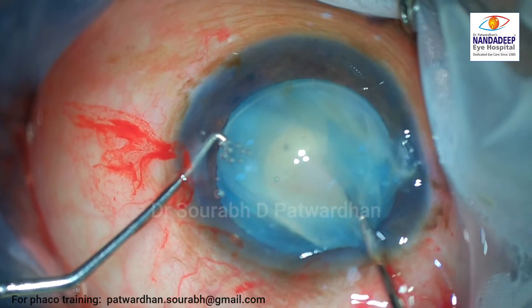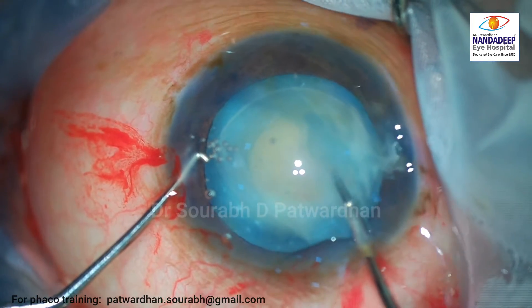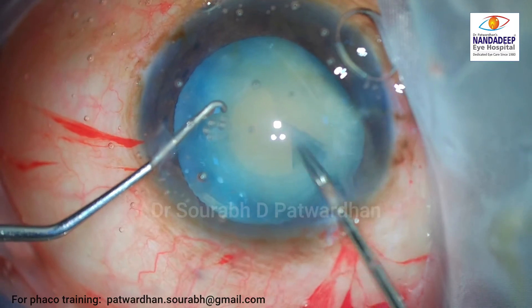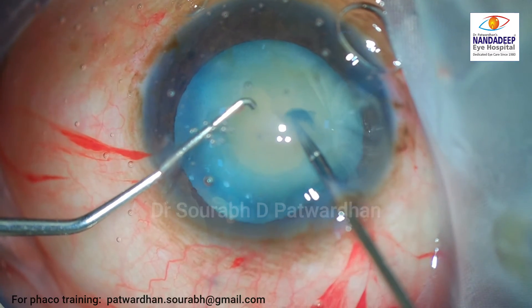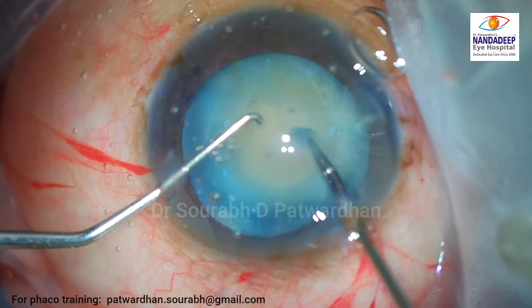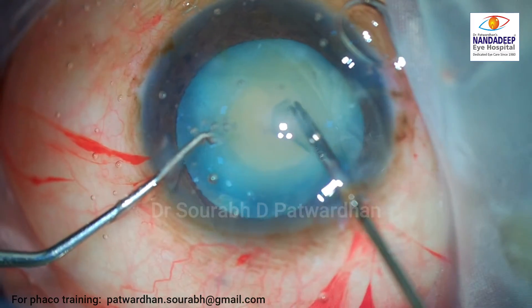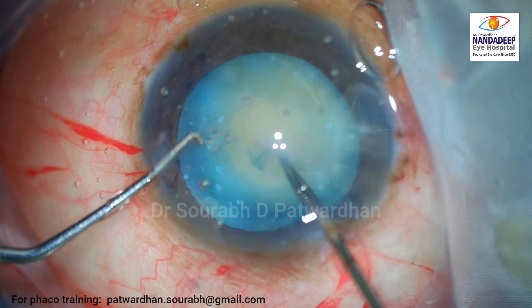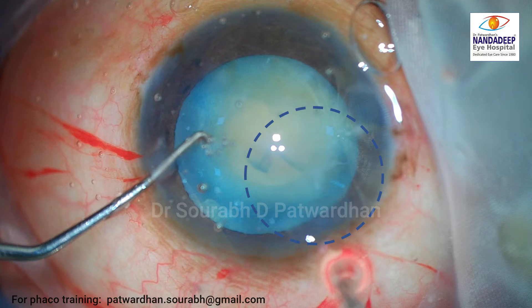The surgeon decides to go ahead from the main incision because of significant resistance and the capsulorhexis edge is not progressing. Finally, the surgeon decides to call me. As I try to push the capsulorhexis edge, it's not going ahead but rather pulling the bag itself. That means it is stuck somewhere — as I notice now, there is some subcapsular fibrosis in a small area where the capsulorhexis has become stuck.